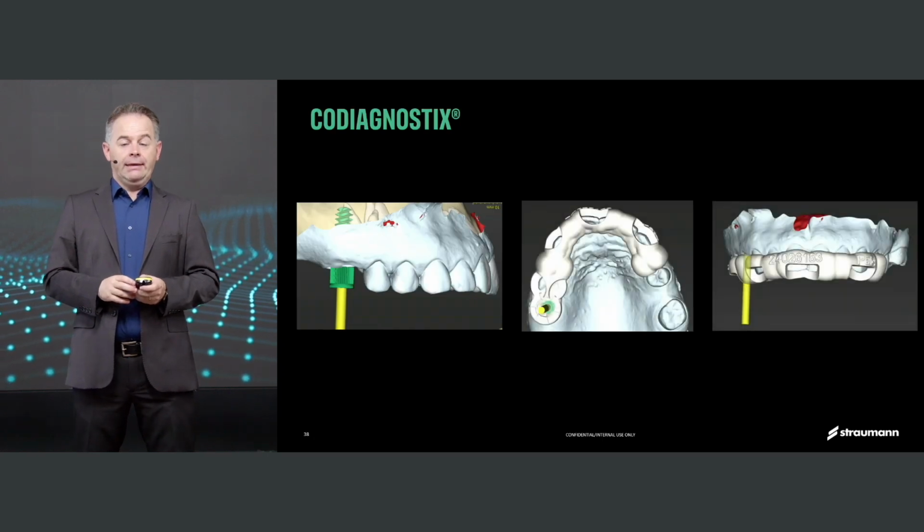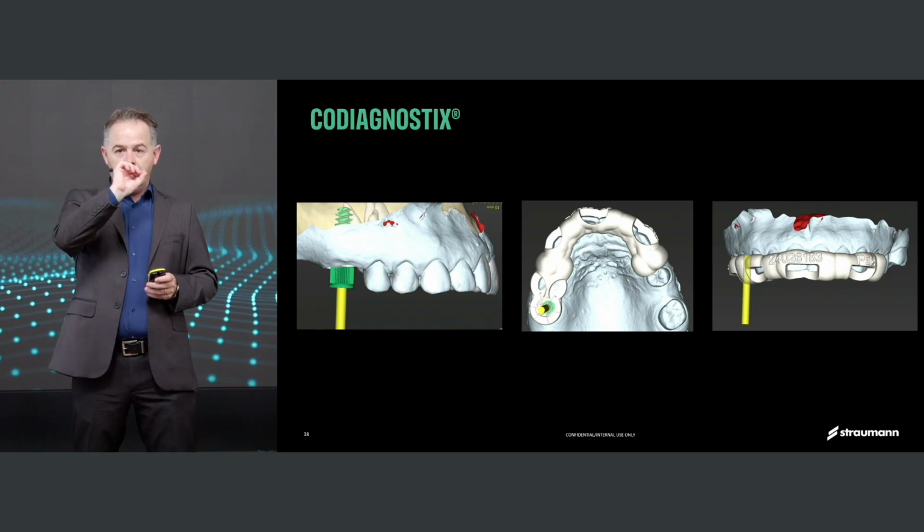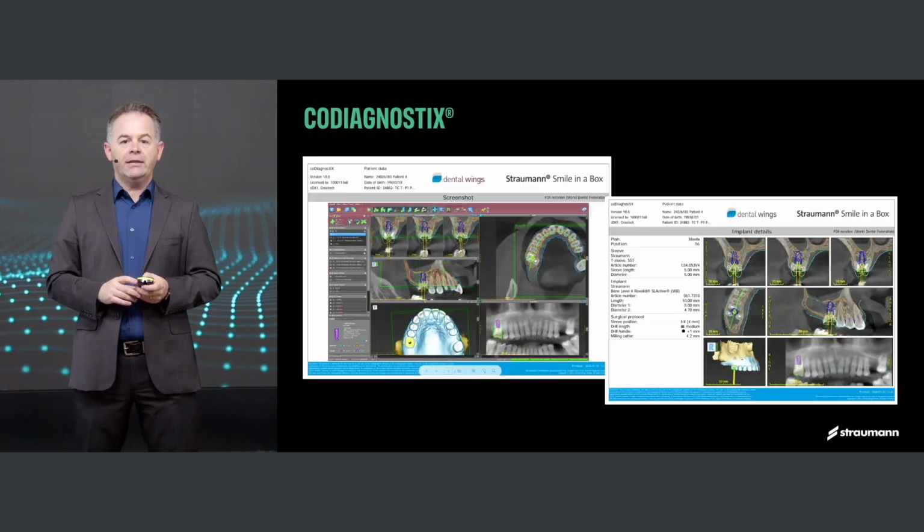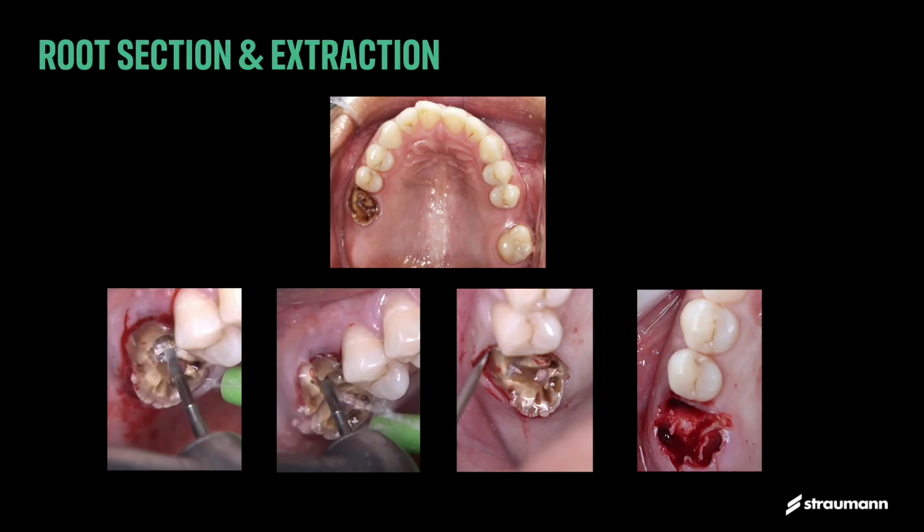We also designed the guide, providing the windows to observe if the guide is properly fit. And with this, we get also the co-diagnostics planning. And with this, we start the surgery. It's a first molar, it's triple root. So we start sectioning the roots in 3 parts.